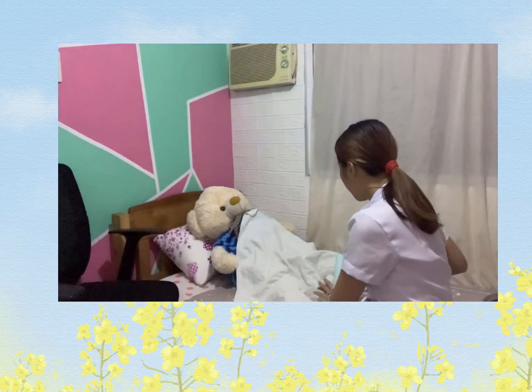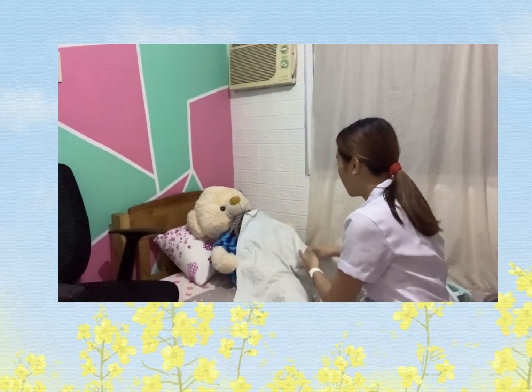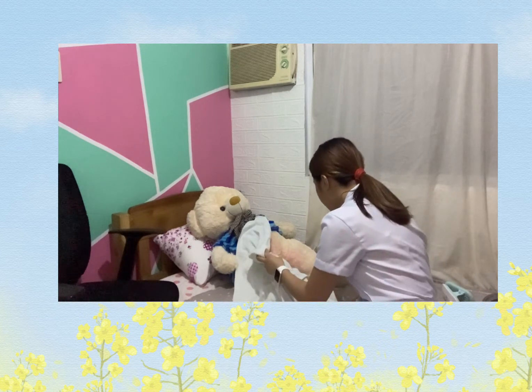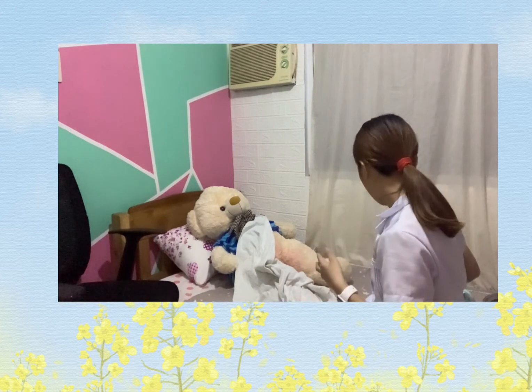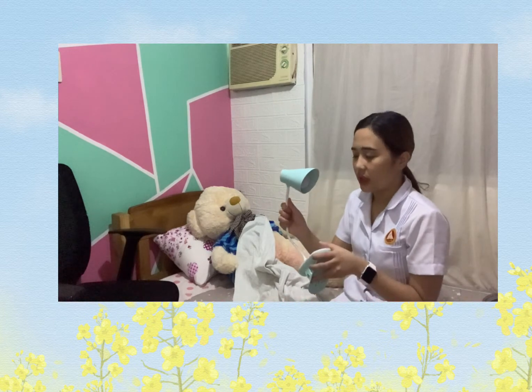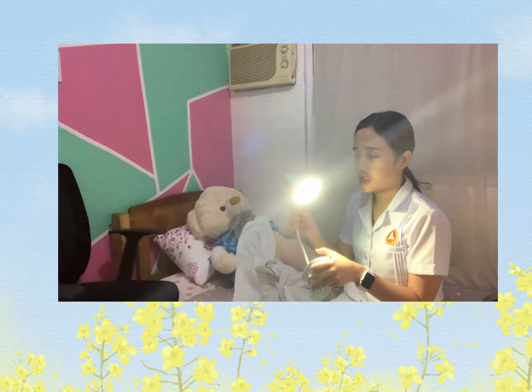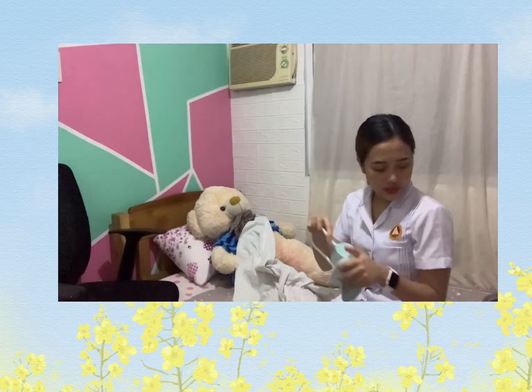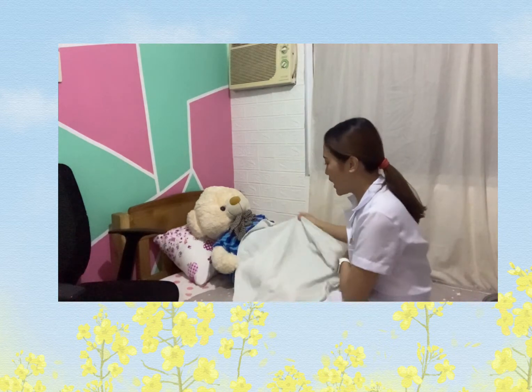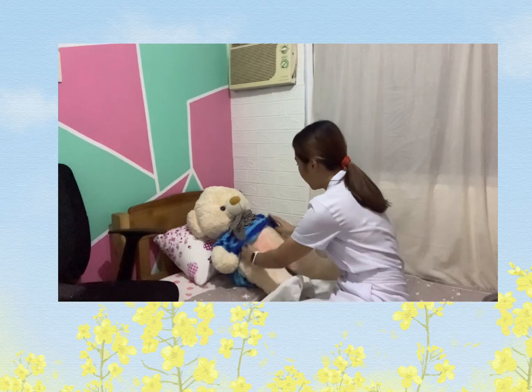And then, we will assess if there are any untoward reactions such as irritation or burning. There are no untoward reactions found on the patient. Now we will make sure that all of the equipment is still in good working condition for future use. And then, we will help our patient into a position of comfort.